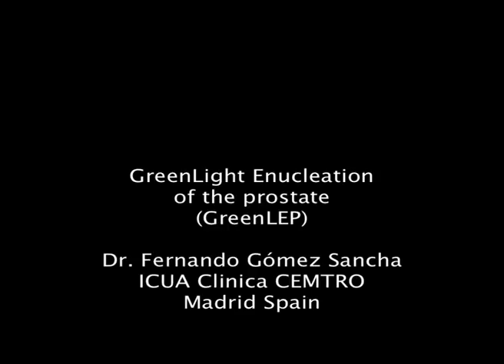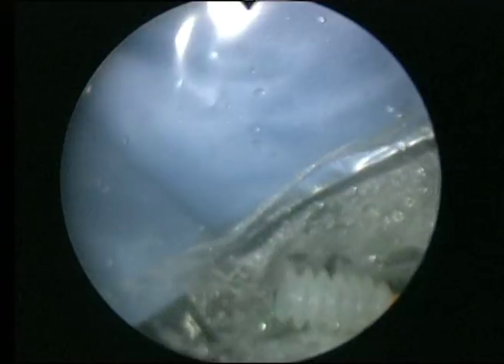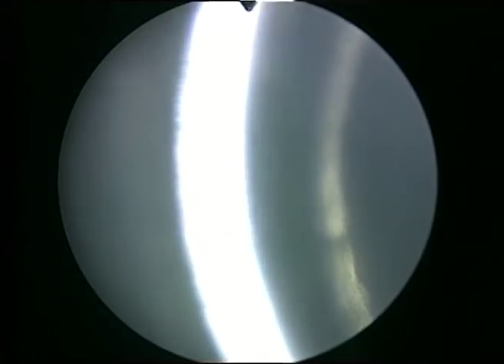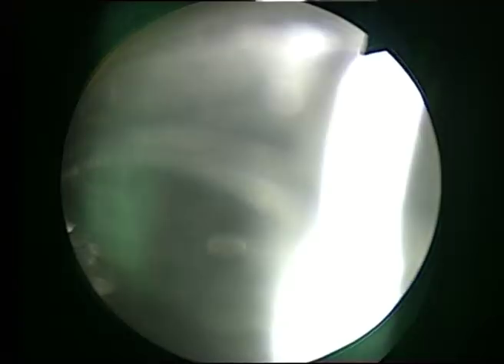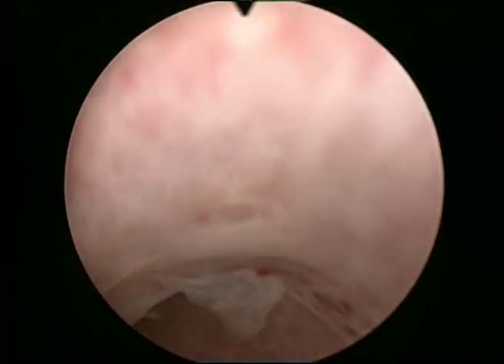Hi, this is Fernando Gomez-Sancha. I am presenting this video of a green light enucleation of the prostate. Many people have heard about this procedure but there are very few videos of it, and I would like to demonstrate today the steps of this procedure. I think you will enjoy the whole thing.